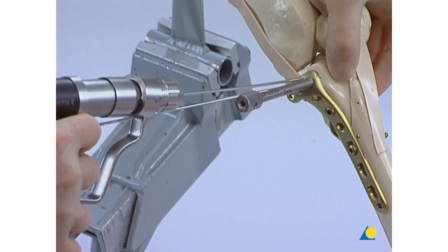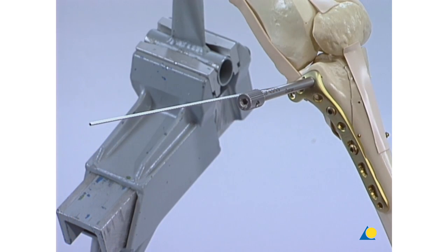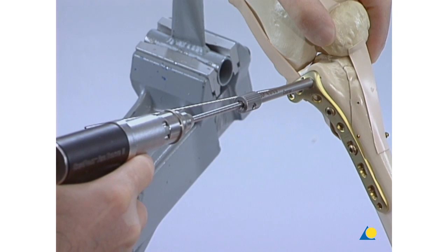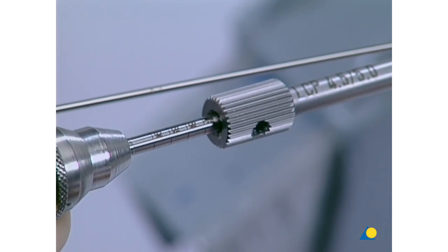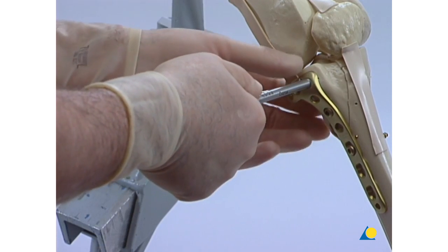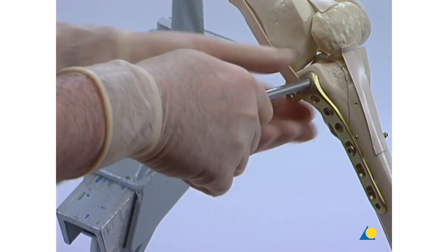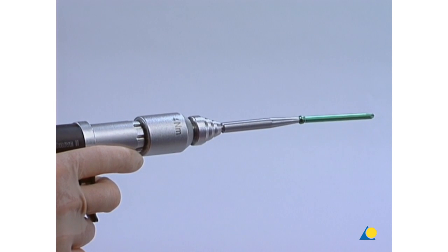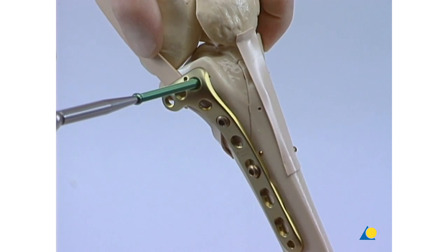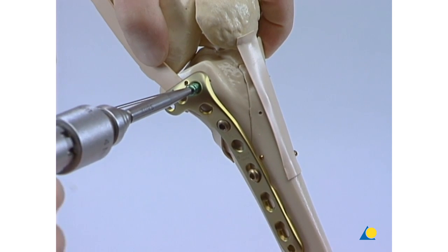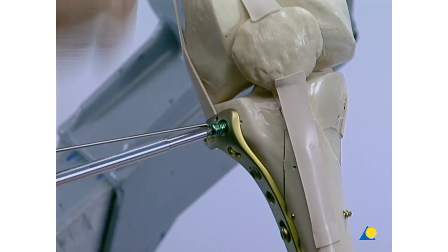The anterior K wire is removed to avoid collision with the drill used for the anterior hole of the proximal end of the plate. A hole is drilled using the 4.3 millimeter drill bit. The screw length can be taken from the markings on the drill shaft. The drill sleeve is removed. The 4-Newton-meter torque limiter is used to insert a 5.0 locking head screw of the appropriate length. After beginning with a power tool, the insertion is completed by hand using the large hexagonal screwdriver with integrated torque limiter.